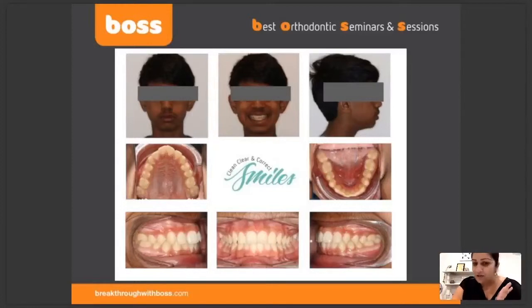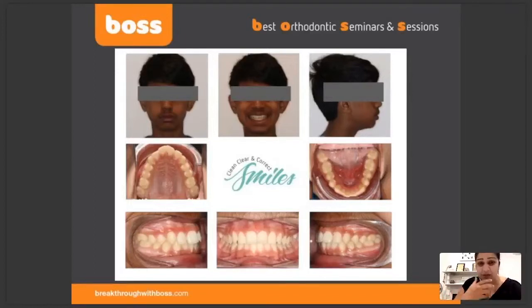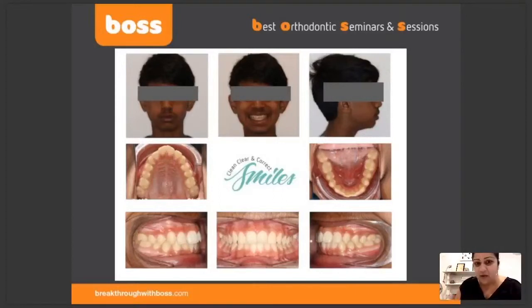Make sure that your team or yourself trains to take every photograph in that position. When you look at occlusals, please make sure you flip the photographs vertically. Occlusals are taken with a mirror. We've got a lip retractor, a mirror — look at the amount of extension, beautifully taken and beautifully edited. The tongue is all the way out and we can see all the way to the seventh. So these are the kind of photographs you've got to get used to taking — you need the right equipment.